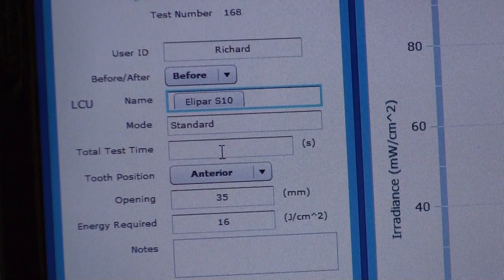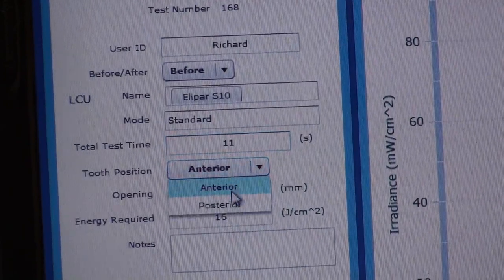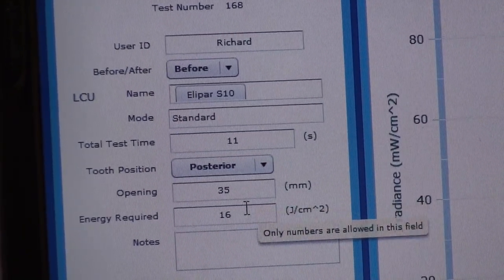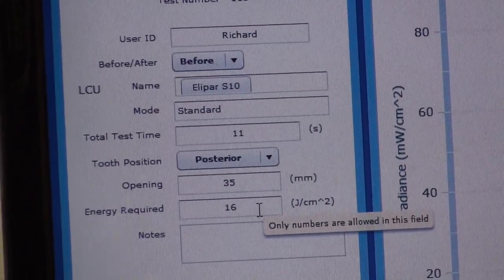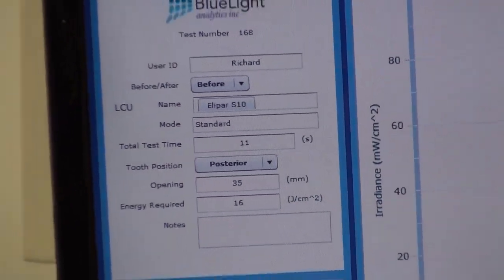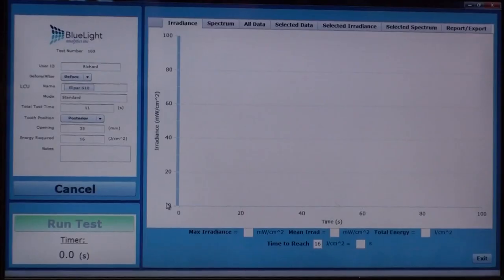We have the modes we can choose. We'll set the time for 1 second longer than the light will actually be on for. We'll set the mouth opening and the energy that we think is going to be required to adequately cure the resin restoration. We'll now click Run Test. And now we're ready to start collecting data.